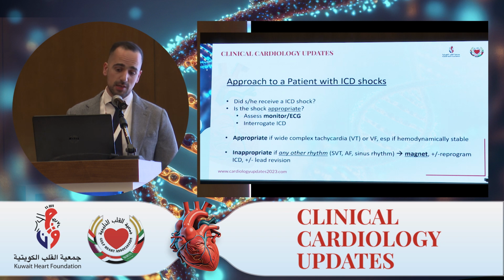But once you're sure he has an ICD and he's been shocked, the next question you ask yourself is, was this shock appropriate? If you're lucky and the patient is very unlucky, they are being shocked right in front of you. In that situation, looking at the telemetry or getting a quick ECG will allow you to look at the rhythm, analyze, and decide, should he be shocked for this rhythm? However, a lot of times the patient will come to you, he says, I got a couple of shocks, but by the time he gets to you, he's in sinus rhythm.